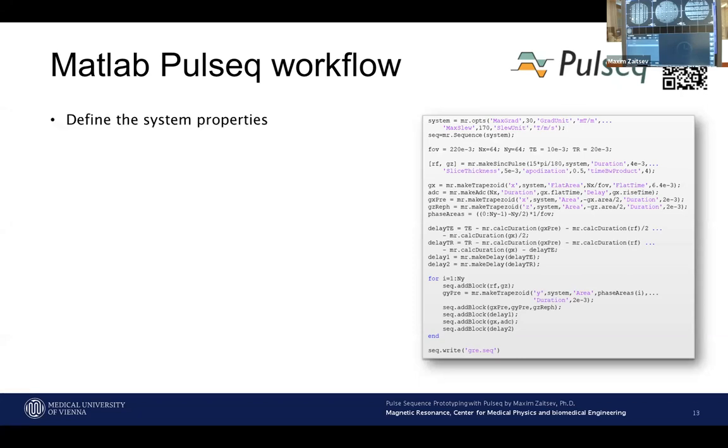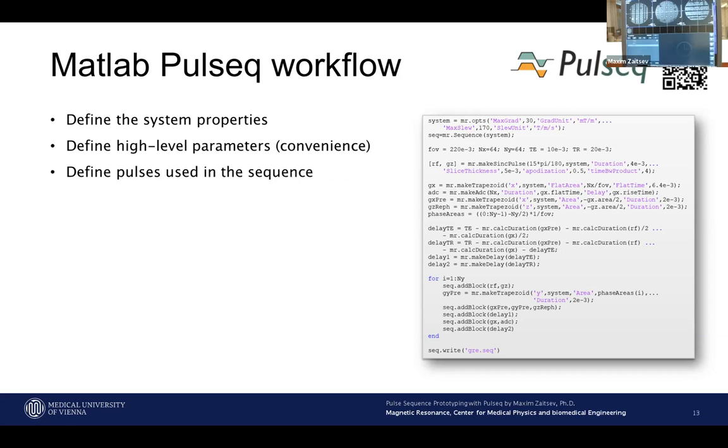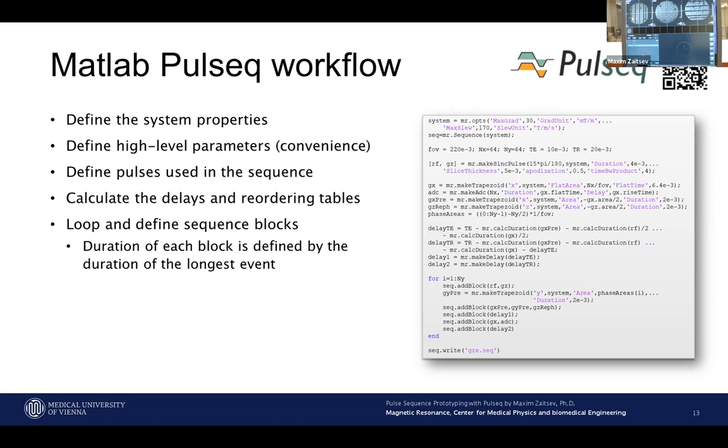And how we do it, we basically define the system properties in the beginning. We define high-level parameters, but it's more or less convenience. You can really write everything with numbers if you feel like. And just define your pulses, calculate the delays, and maybe reordering tables if you need them, and just go through the loops the way you like it. You can have multiple loops, you can have everything written in spaghetti code. Basically fill up the block table. And then you export the sequence to the text file, and then you copy the text file to the scanner.